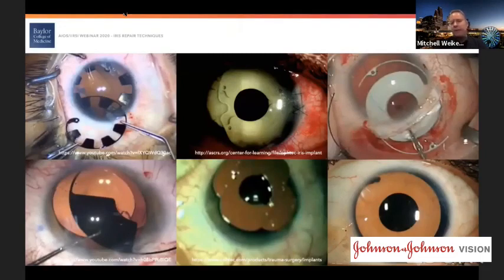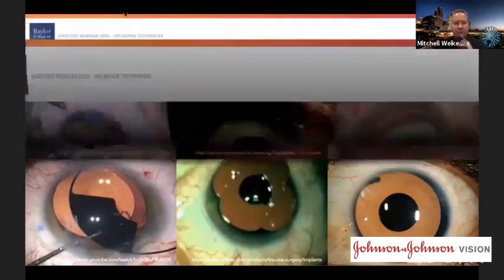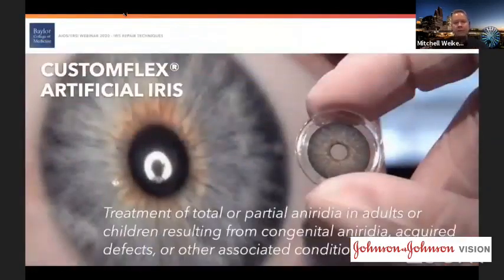And we used to have access to the Optech IOL, a sutured IOL that had an iris aperture in combination with the IOL, but we lost access to that several years ago. But finally, we've recently received access to this CustomFlex artificial iris, which is produced by HumanOptics. And it's indicated for the treatment of total or partial aniridia in adults or children. And that can be from multiple causes: congenital aniridia, traumatic defects, et cetera.